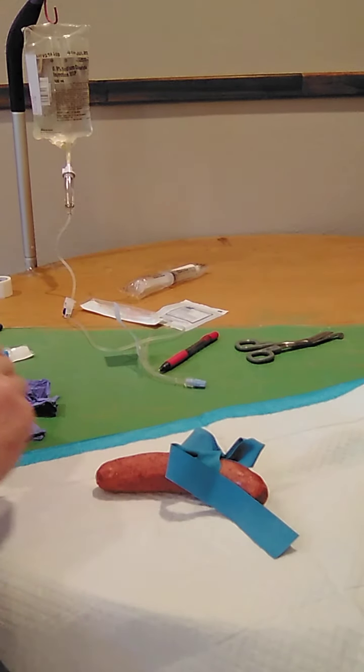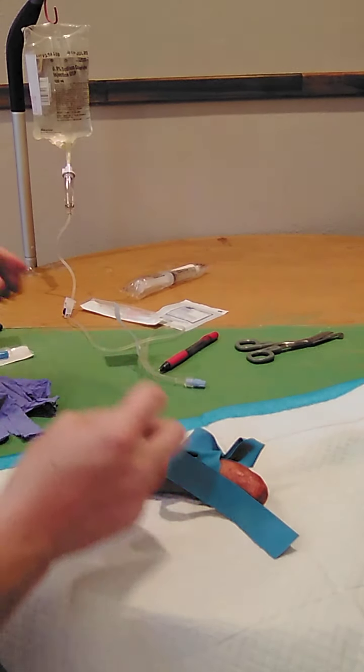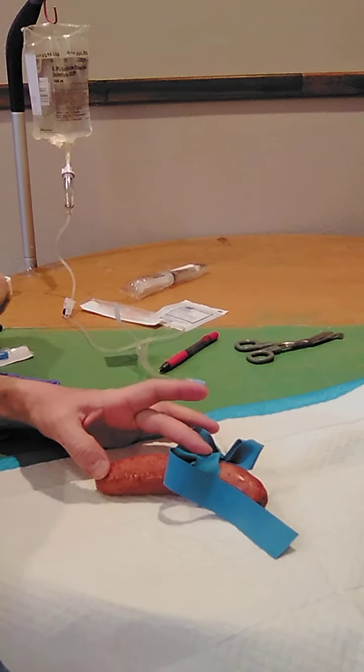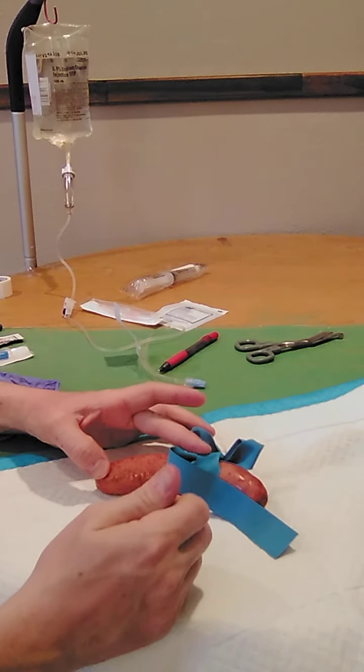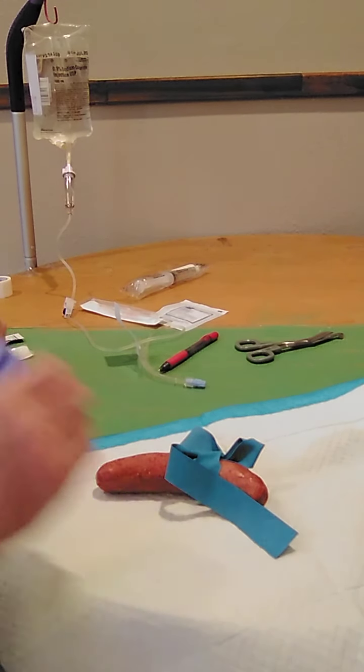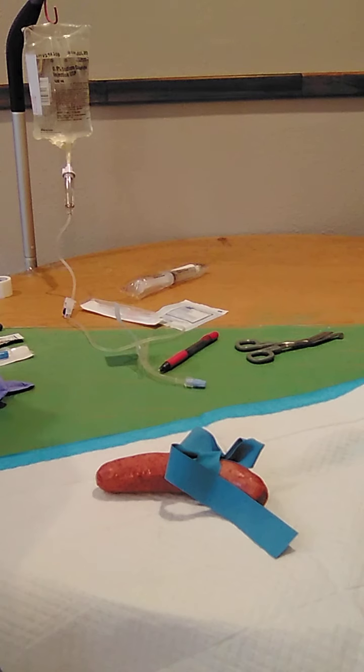Okay, so I'm easily visualizing my IV site. I'm going to clean from the central out, allowing that to air dry. Give that a moment. I'm going to don my clean gloves.